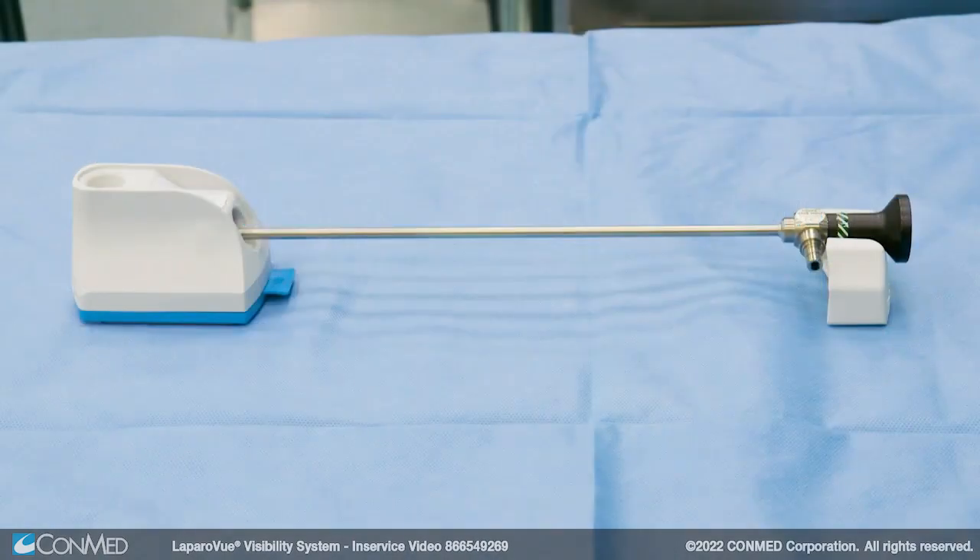Laparovue is designed to be kept on the back table, but if the unit is brought to the scope instead, keep it no more than 45 degrees from the upright position to prevent surfactant from escaping the cup.